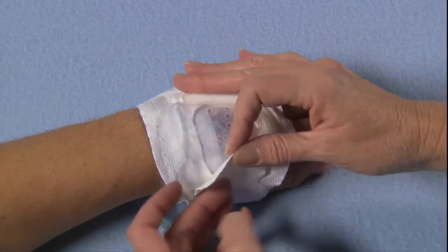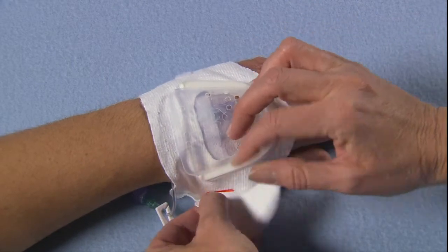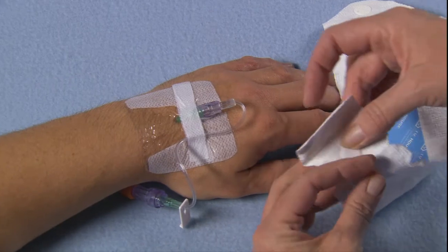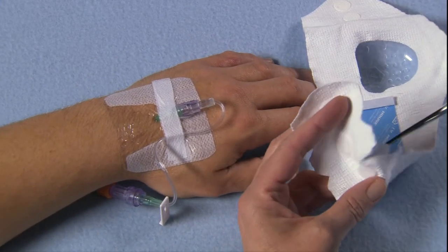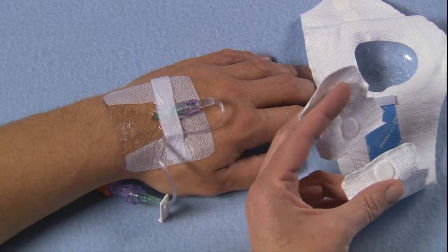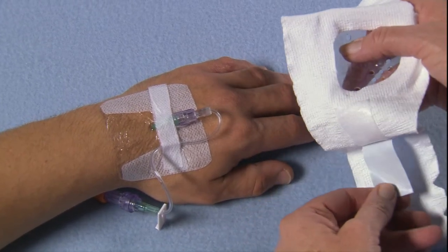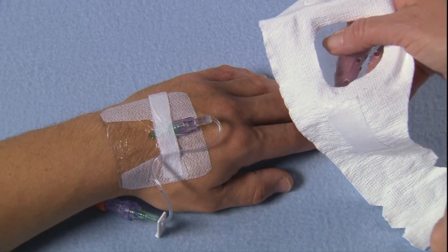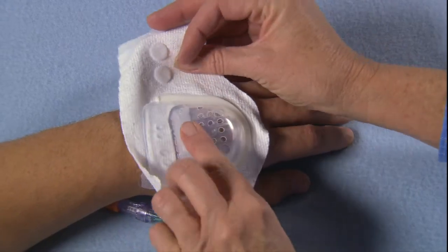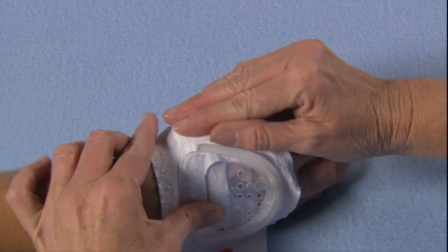From emergency department admission to hospital discharge, IV House products extend dwell time of the IV, reduce complications and costs. Properly protected IV sites help eliminate unscheduled IV restarts and multiple IV attempts. Care and maintenance of IV sites is essential. IV House products are designed to provide instantaneous access to IV sites so nursing assessment can take place immediately. Early detection and intervention of IV site malfunction is essential to eliminating serious injuries.